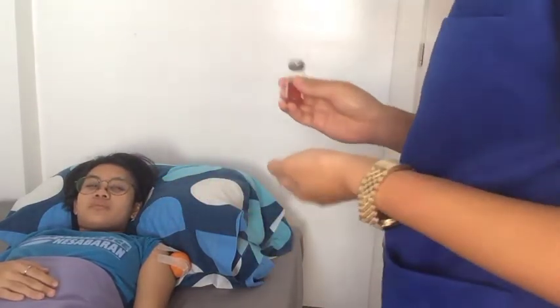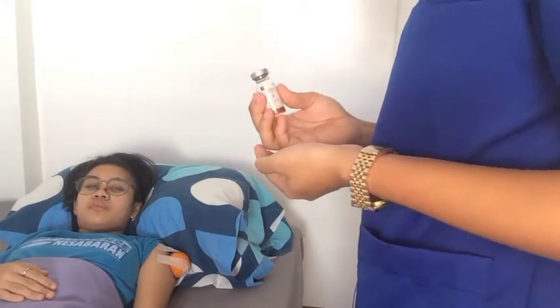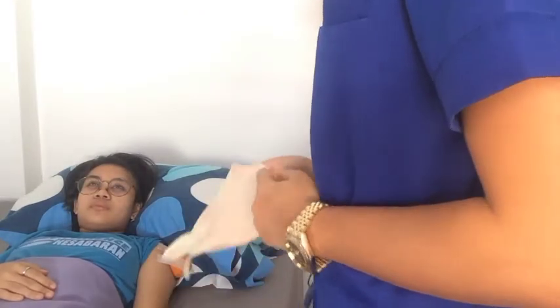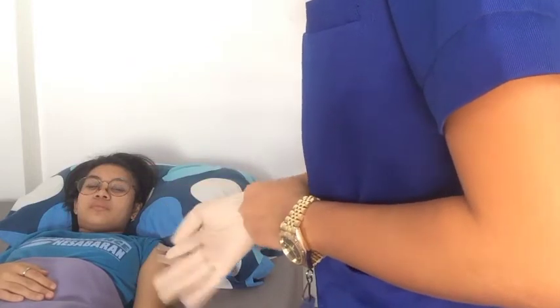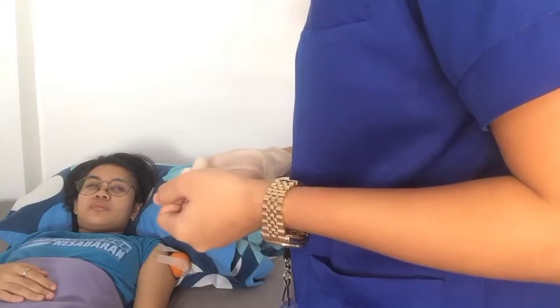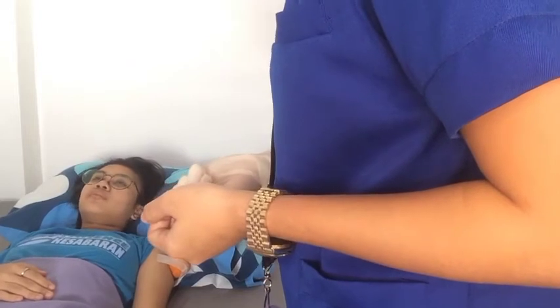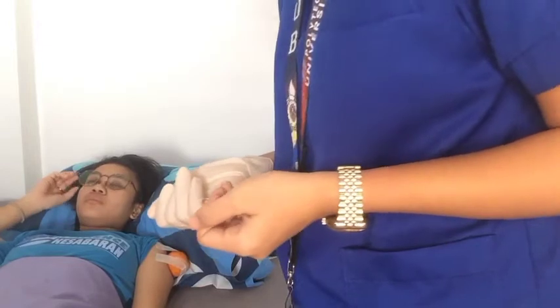So now, I'll check again the label of the medication. So, in selecting a site of the area, there should be no skin lesions, tenderness, swelling, hardness, or localized inflammation, and one that has not been used frequently.